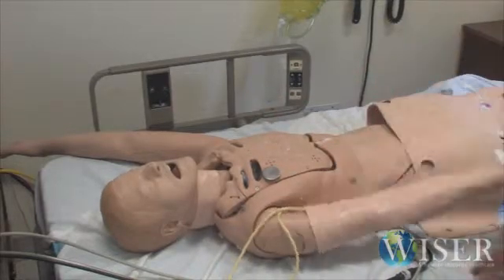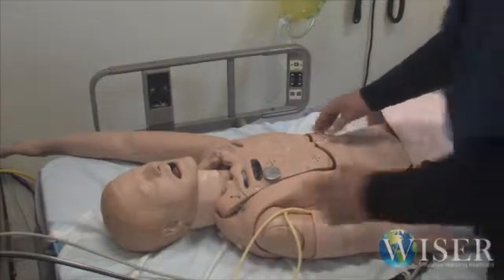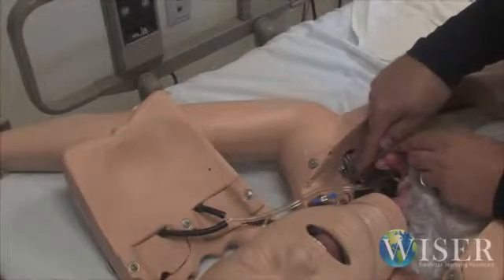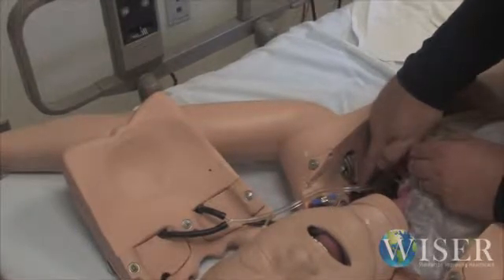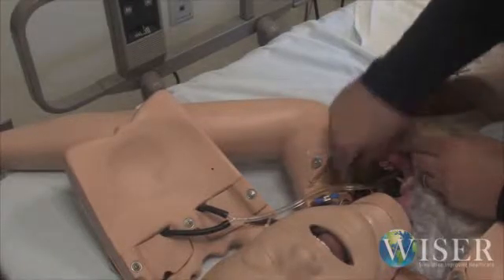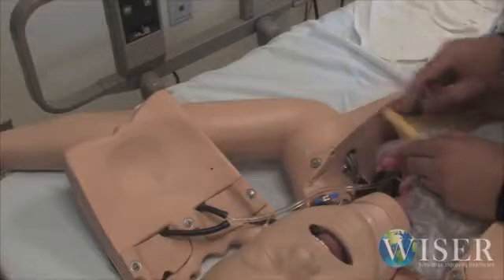Once you know that isn't what's going on and that's in place, we can get under the chest skin. Lift our chest plate out. See under his left lung, this connection here is the connection from his board that drives the pulses. If you see that's in place, it's probably not your issue.